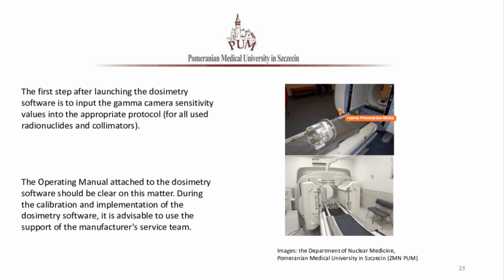Usually we need 3D acquisition of a cylinder filled with the solution of radioisotope for the purpose of studies. You can use a Jaszczak phantom cylinder or a NEMA cylinder, which is shown at the bottom. We also need to calibrate the sensitivity.